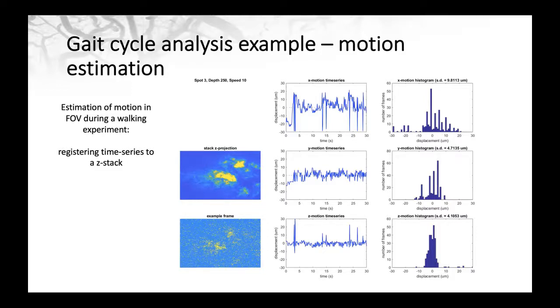So when I say the z, there's the surface of the spinal cord, and this is the head of the mouse, this is the tail of the mouse. There is some motion in this direction, but not much in this direction. For example, when the mouse bobs its body up and down. So that's actually pretty good. That's one of the major things we had to overcome.